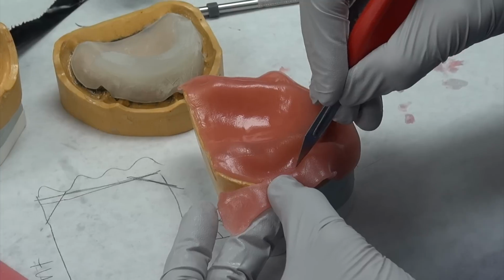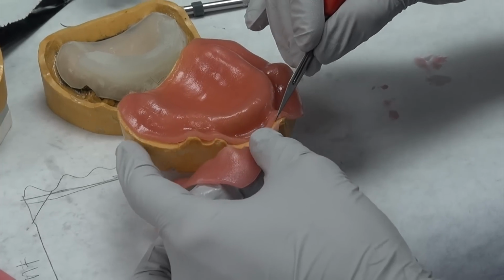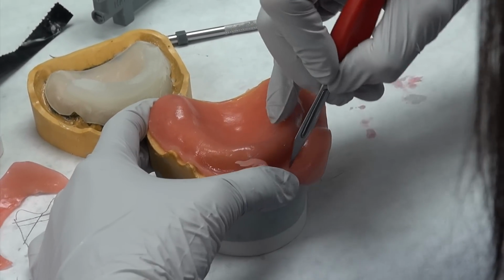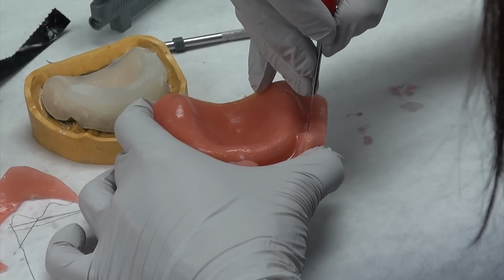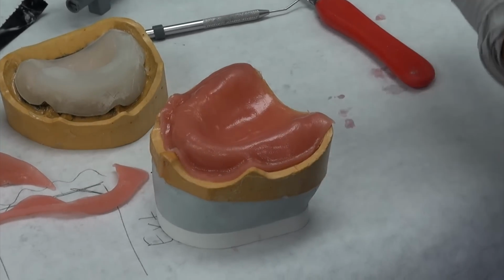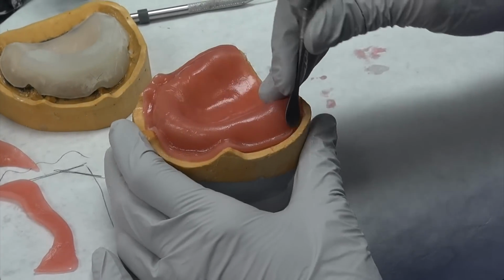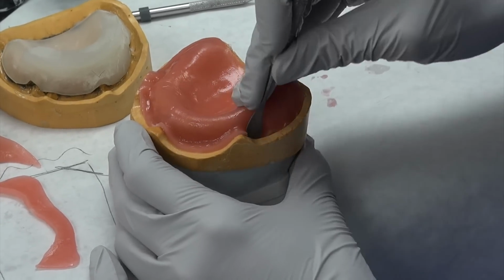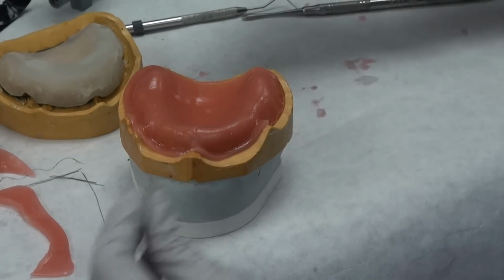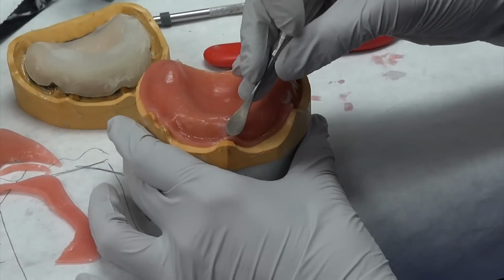is taking the knife and cutting along the land area. Right, so we're cutting over. So all of this excess material we have, we can just tuck it in. Okay. So you want to cut it over, but not too far over. One of the reasons is because when you tuck it, if it's too far over, it will start to fold, and that will create air bubbles.